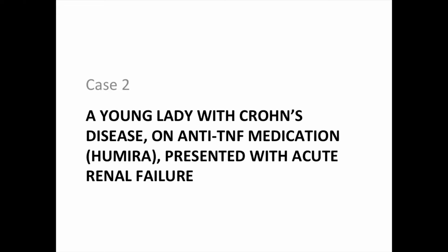Okay. You missed the tram track on silver. I don't think we had a tram track in this case. I didn't. Not on this case. Yeah. All right. So very nice.